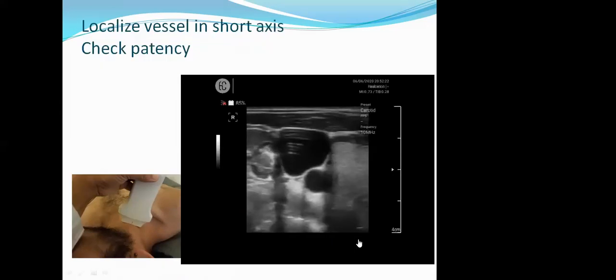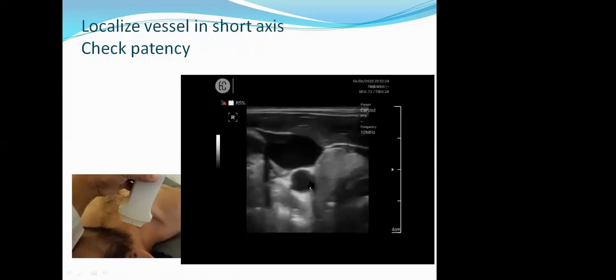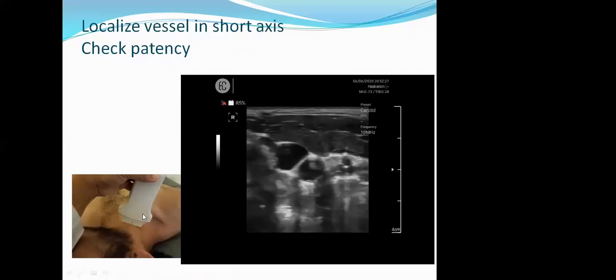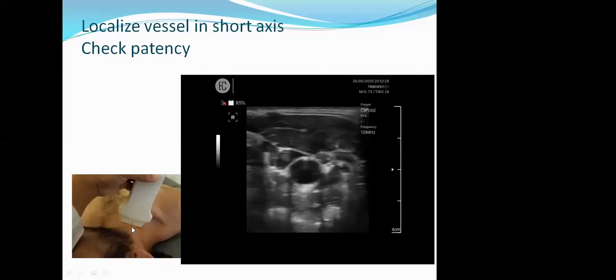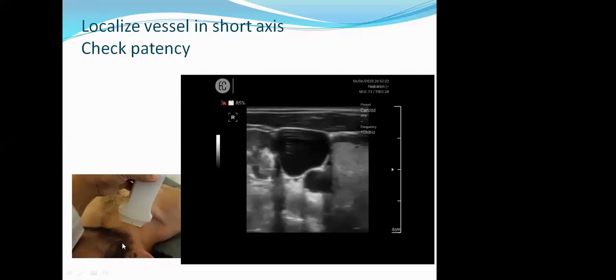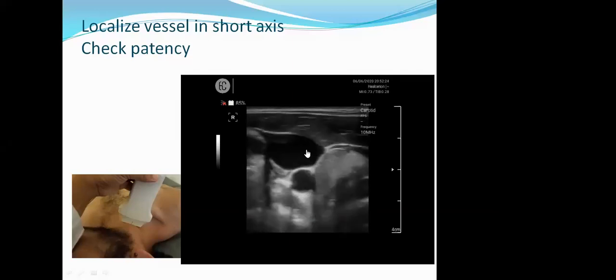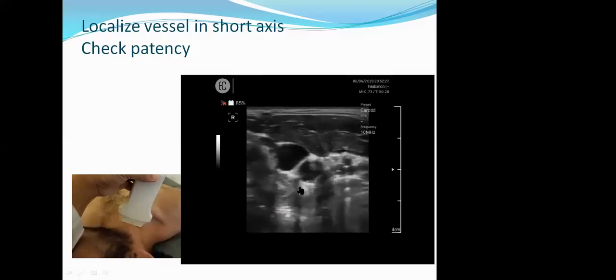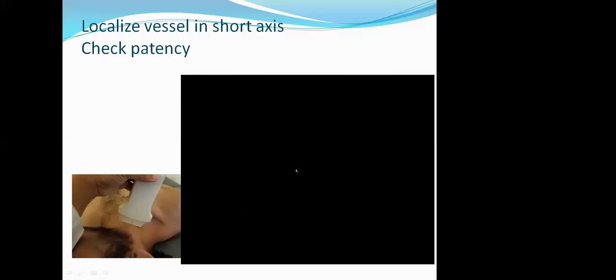So this is the video clip. Look over here. This is the carotid, and this is the internal jugular vein. I'm scanning from the clavicle all the way towards the patient's face. Look at the movement of the vessel. It collapses with just a slight pressure. It collapses while the carotid is not collapsing.